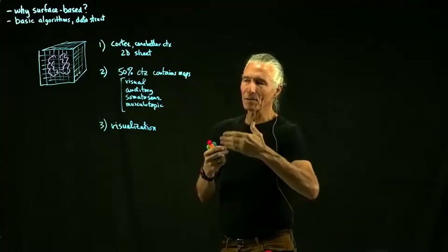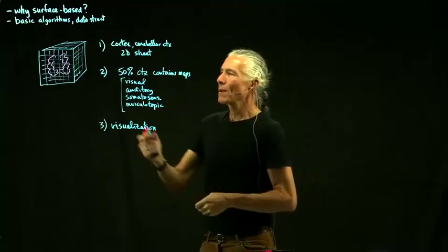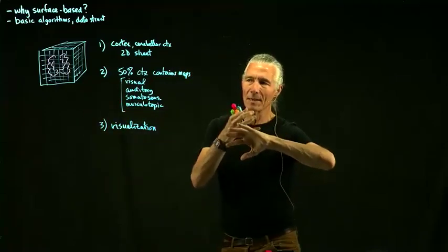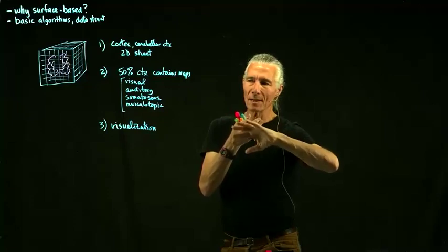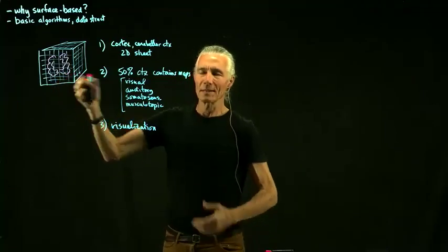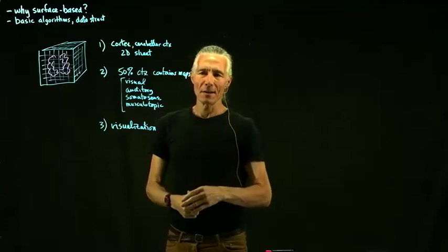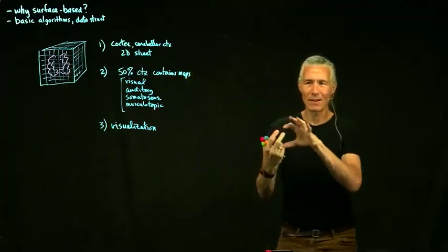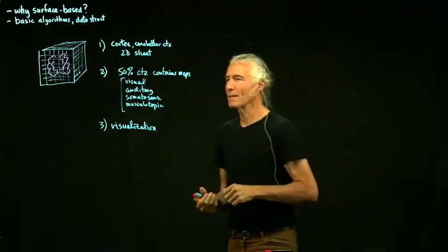You typically see surfaces. Now, if you have two surfaces, you can make a transparent display so you can see two surfaces at the same time. But the brain has 20 or 30 surfaces overlaid on each other. If you just try to make that transparent, it looks like cabbage soup or something like that. You can't really make heads or tails of where stuff is.